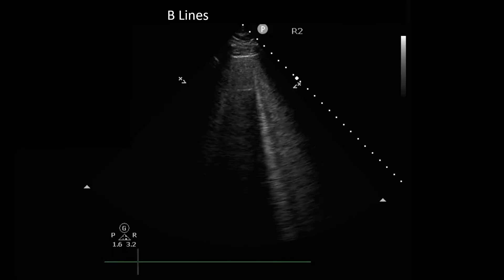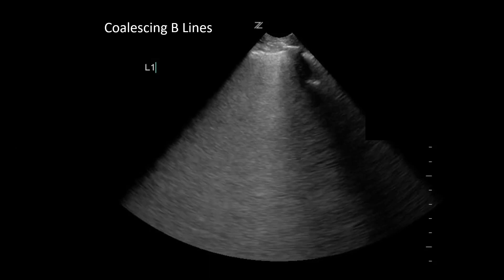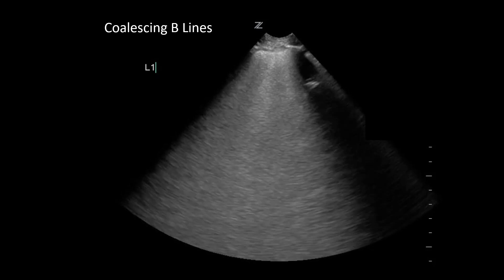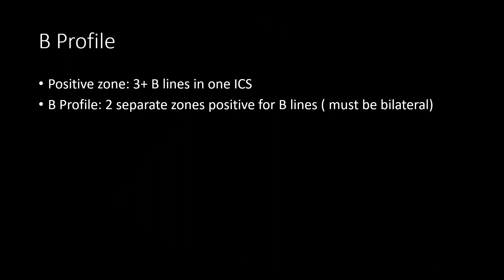Here's an example of B-lines. B-lines are a discrete, laser-like, vertical, hyperechoic reverberation artifact. They arise from the pleural line and extend to the bottom of the screen without fading. They move synchronously with lung sliding. In this example, the B-lines have become more numerous and are coalescing together. A B-profile can be diagnostic for CHF in the correct clinical context. To diagnose a B-profile, you need at least three B-lines in at least two zones bilaterally.